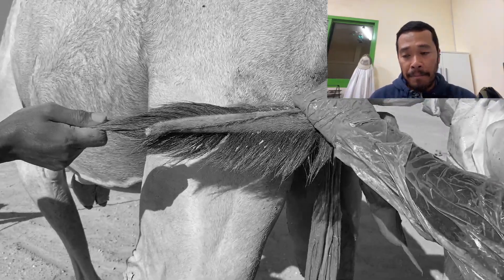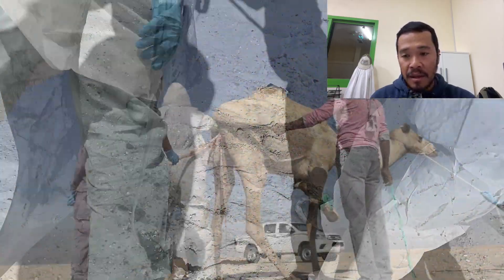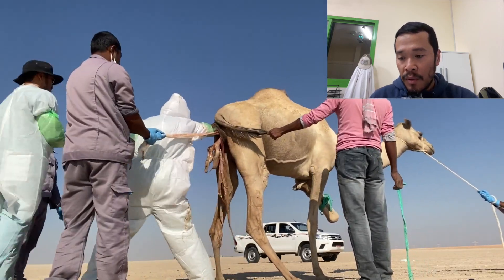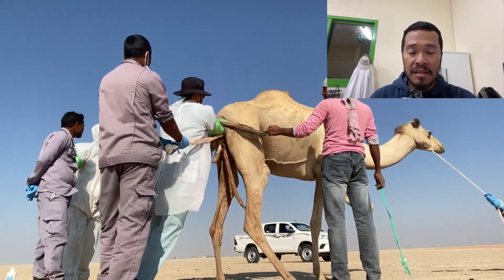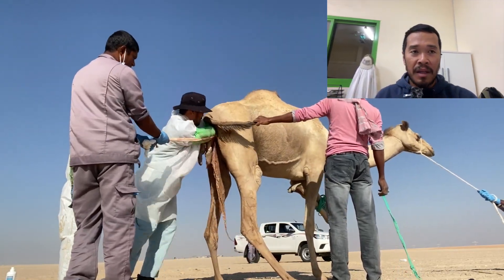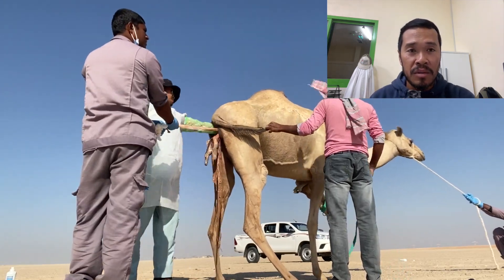In our clinic we don't have the facility to perform a cesarean procedure and we don't have a surgeon to do it, so this was the approach we took for this case. When we arrived at the scene, the camel was already in distress — lying on its side, then standing up and sitting down — obviously trying to expel the fetus.